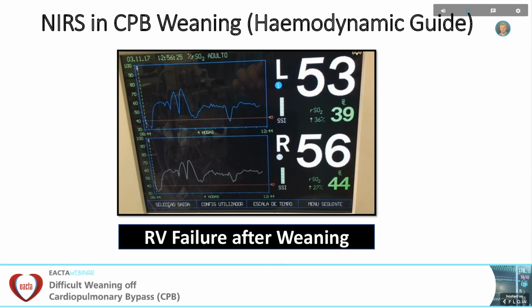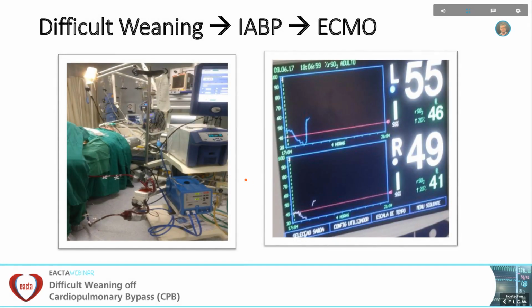We can use it for driving some decisions on ventricular assist systems or ECMO. In this example, we have an instability in the postoperative period. The patient needs intra-aortic balloon pump counterpulsation. We talked about the balloon pump to put on the ECMO, and you see here the level of perfusion is low, and we took the balloon off. The patient has instability, and then he recovers after ECMO to a higher level of perfusion.